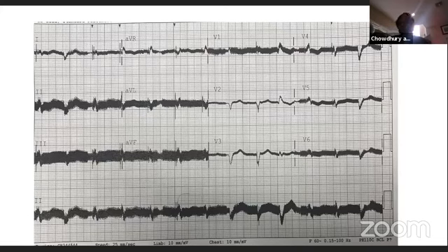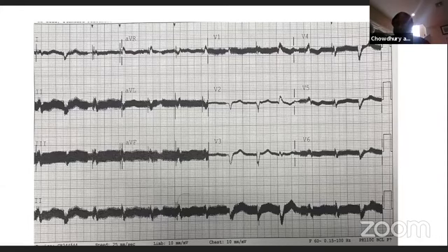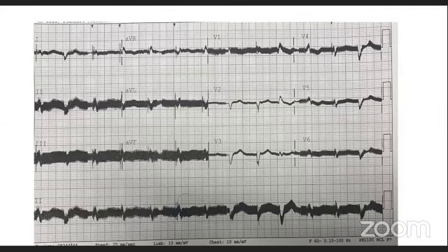I see this. So what was the hemodynamics? What was the blood pressure? Oh, this is a HeartMate 3, and the mean pressure was like 80. Sometimes you don't see a pulse pressure. So it also gives a clue: if the blood pressure is okay, then it should be an artifact.